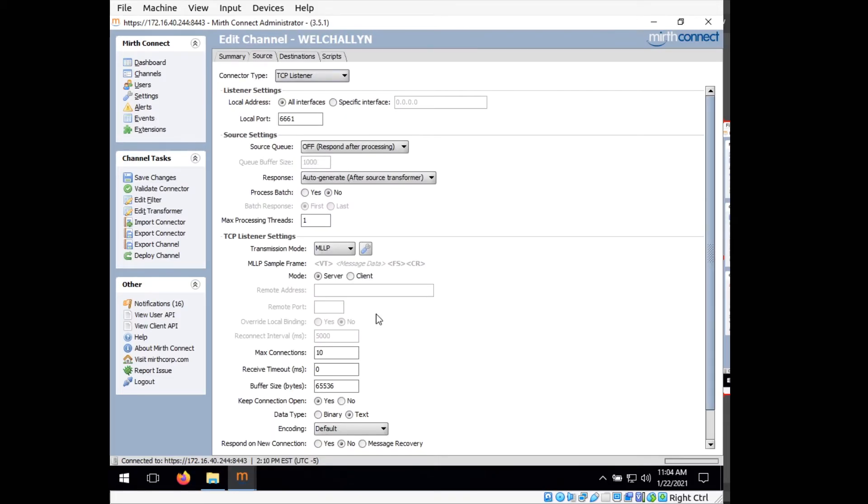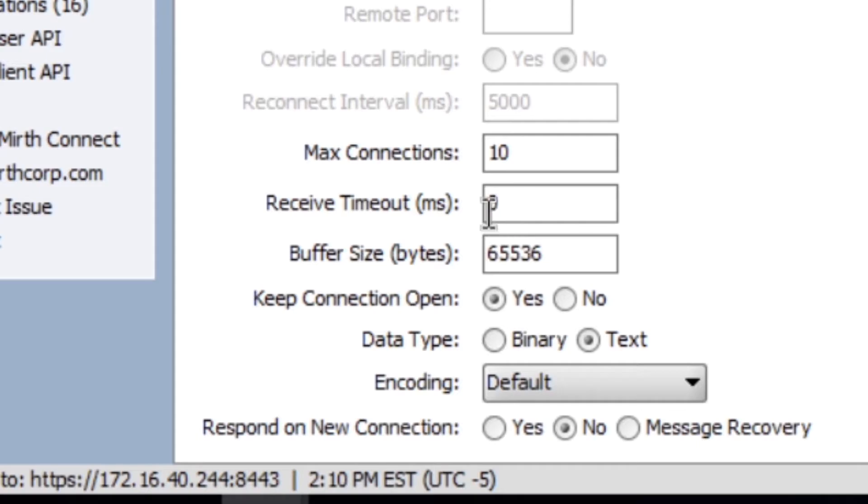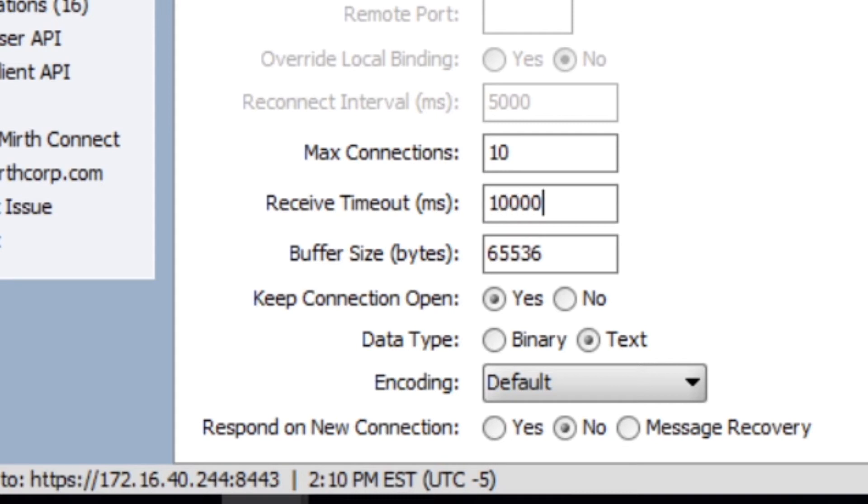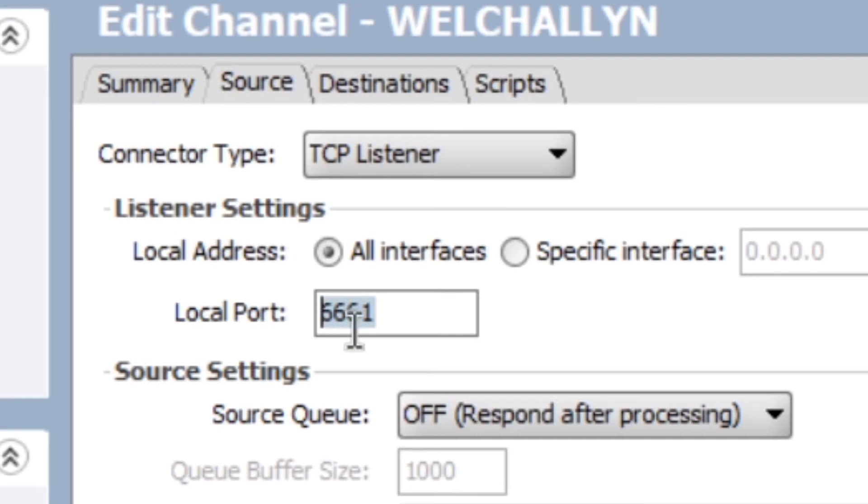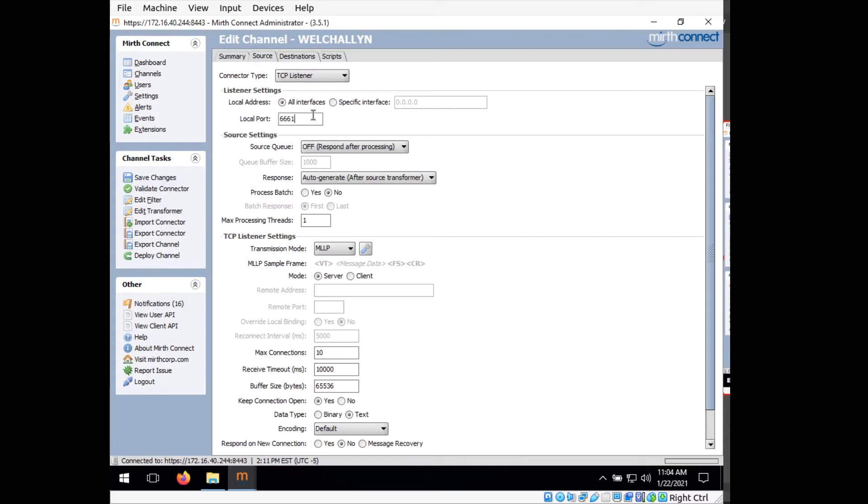And now down here, where it says receive timeout, we want to change it from 0 to 10,000. So this part is what the Welch Allyn is going to see. It's going to connect to this IP address on this particular port, 6661, and it's going to send its HL7 data to this channel.